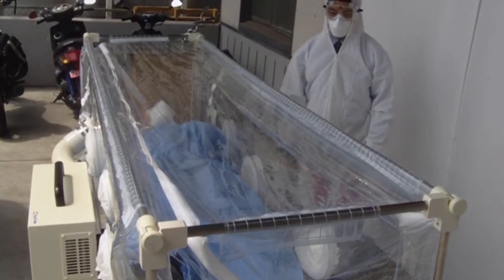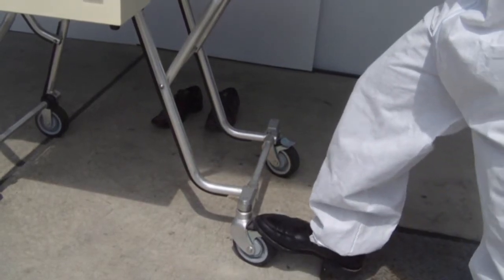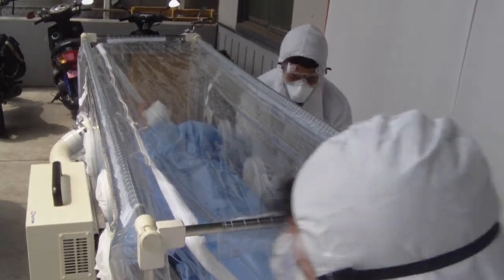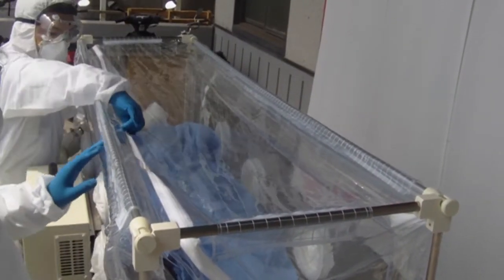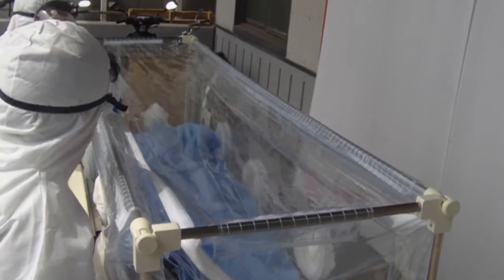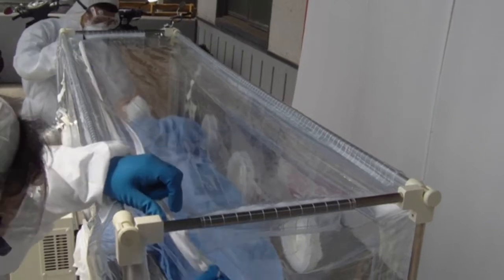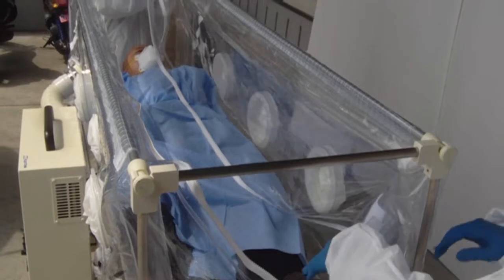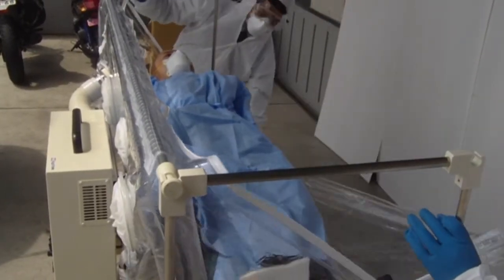Let's unload the patient from the negative pressure carrying bed. The stopper of the negative pressure carrying bed is turned on. The fastener is opened. The sidearm of the negative pressure carrying bed is put down. The vinyl capsule is opened fully. The patient gets off.